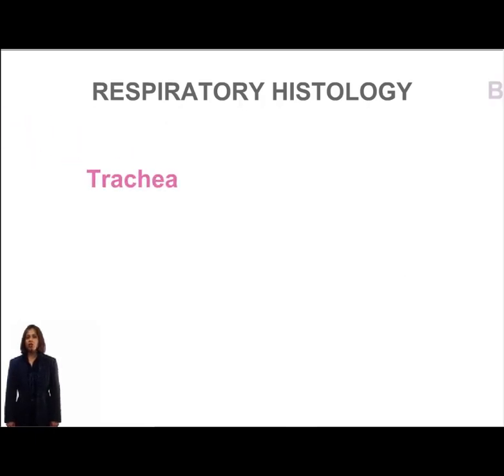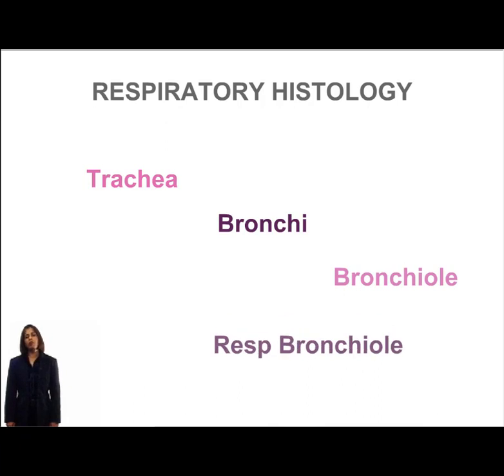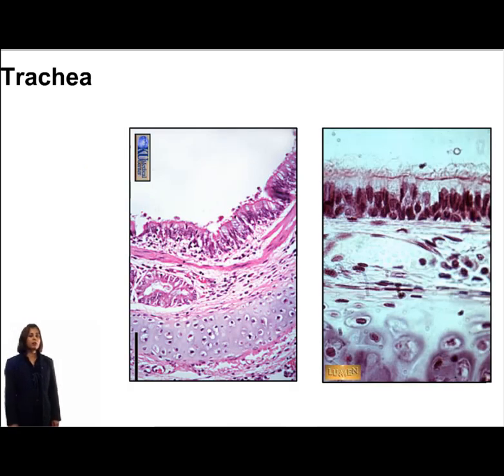I'm going to do a short tutorial on respiratory histology, and I'm using the images from the websites that you were required to visit, which were JDoc HistoWeb and the Lumen website. Let's begin by looking at the images of the trachea.